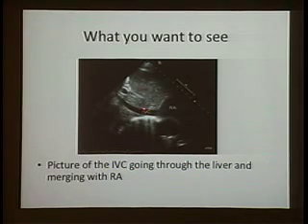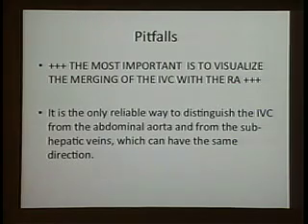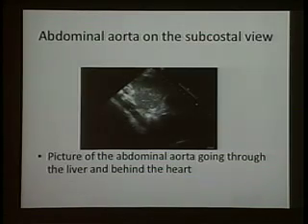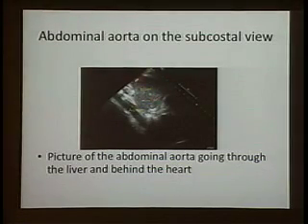Again, pay attention. The IVC has to drain into the right atrium, okay? Because you can confuse it. And I think I have an image where, look at this image here. This is a liver, you have this vessel here. But this is not entering. You have to move it a little bit until it becomes clear.